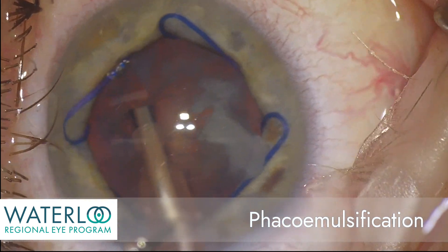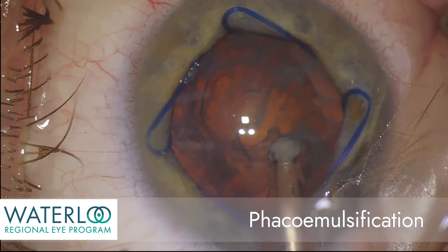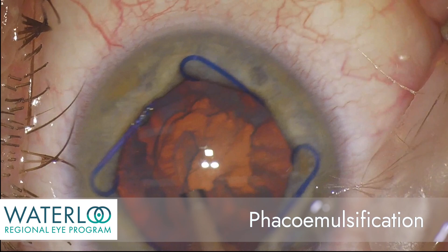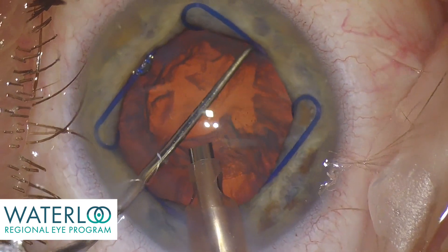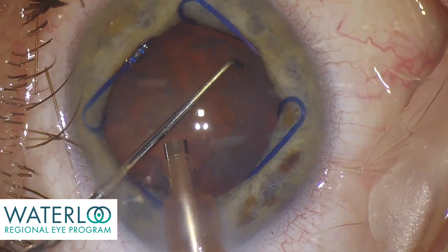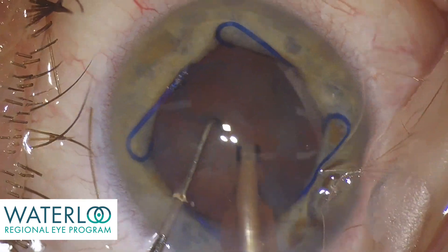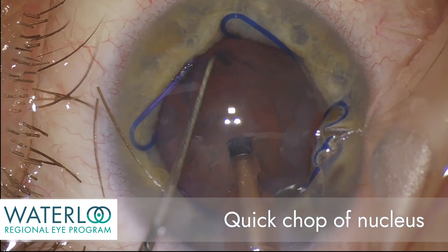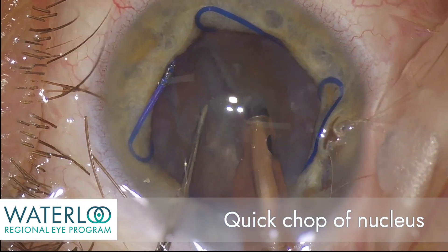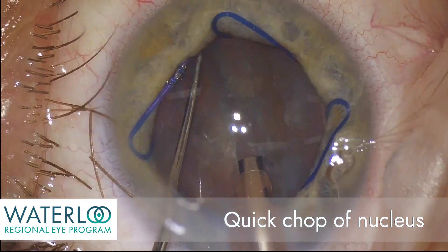Phacoemulsification is a sophisticated ultrasound technology that allows the surgeon to break the cataract up into segments for removal. The nucleus is rotated, and now the nucleus — the central part of the cataract — is divided into two, here using a quick chop technique.